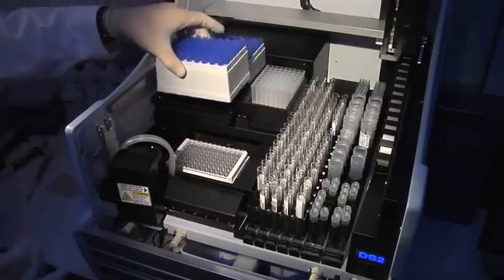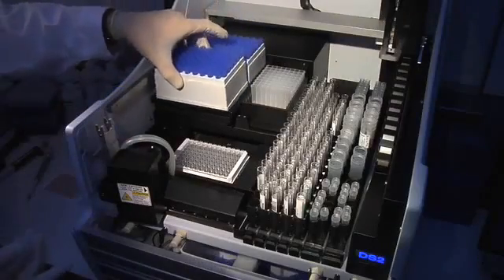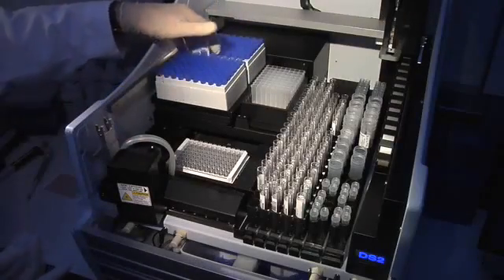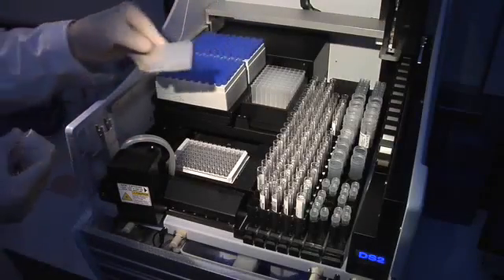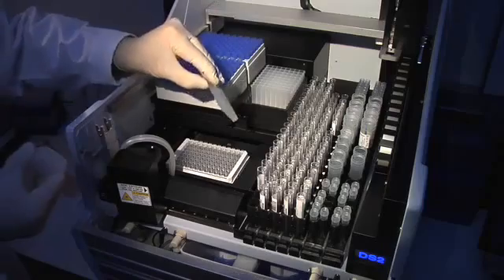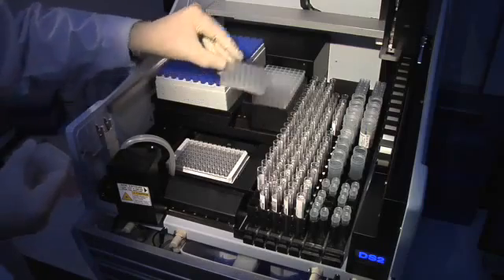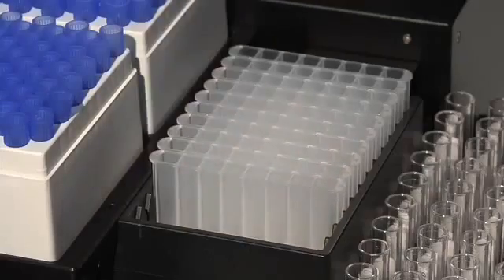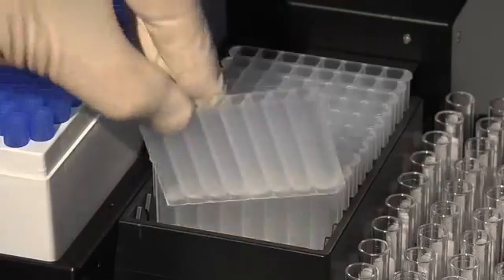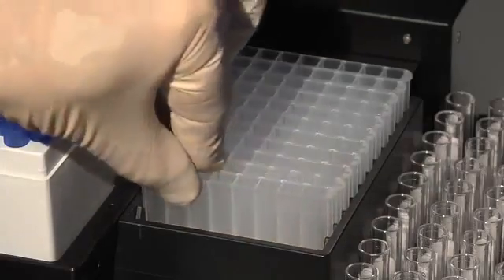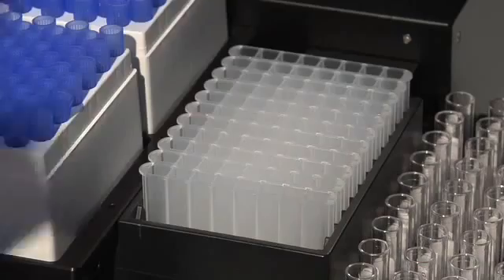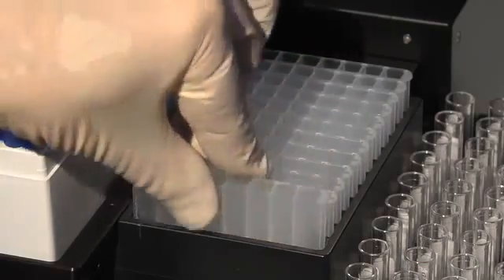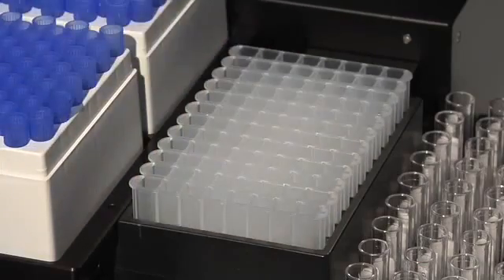Two sample tip racks hold 216 tips total. The DS2 also features economical deep well strips, eliminating waste from having to discard partially used deep well blocks. Load only what you need for your assay run.